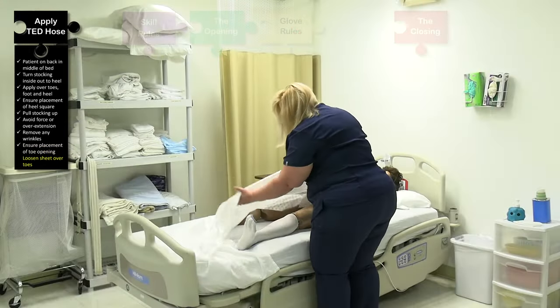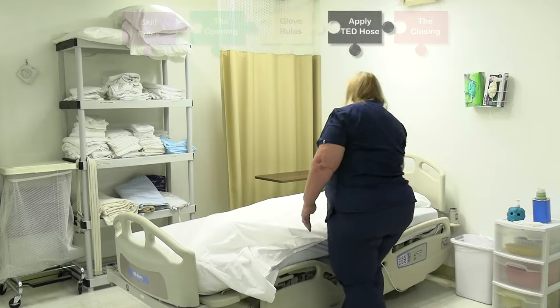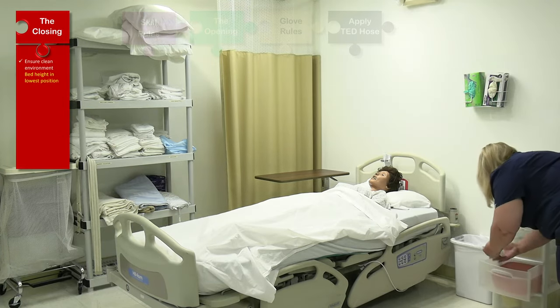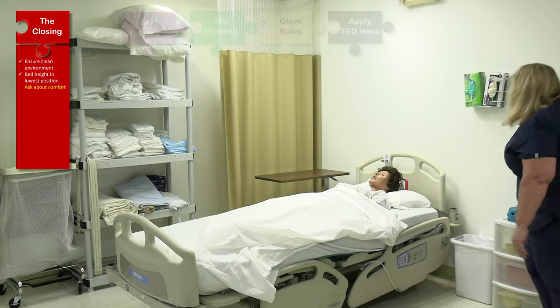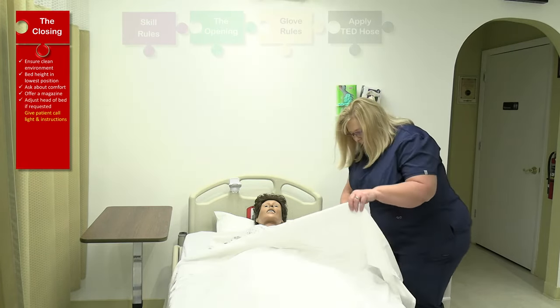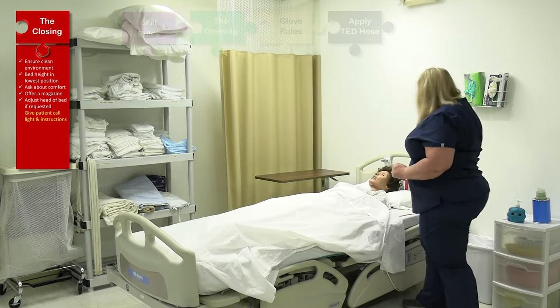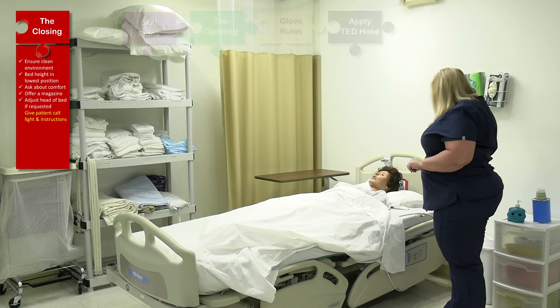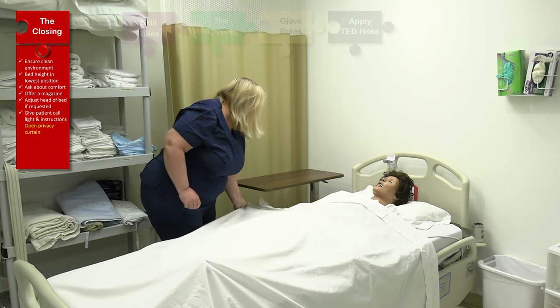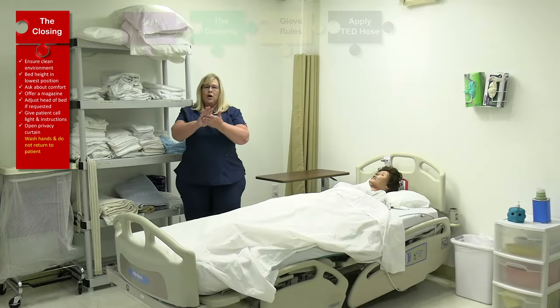Thank you very much, Mrs. Jones. I'm just going to cover you up here. I'm just going to place your other stocking in your drawer for use later. Are you comfortable? Here's your call light — let me place this in your hand. If you need anything at all, just press that button and it will let me know that you need help. I'm going to open your privacy curtain. Let me adjust that sheet for you. Wash my hands.